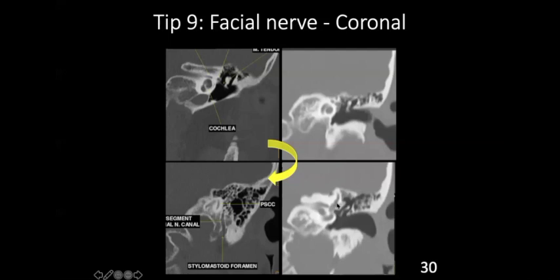In the coronal section at the mesotympanum level, look at the ossicles and the lateral attic wall. You can imagine the cochlea as a swan — the basal turn is the body, the falciform process is there, this is the head, this is the beak, and this is the horn of the swan. The beak of the swan is the lateral semicircular canal. Below the lateral semicircular canal, you see the translucent structure — that is the facial nerve, medial to the ossicular chain. Then the vertical part of the facial nerve is more or less at the same level as the posterior semicircular canal, which is vertically oriented.